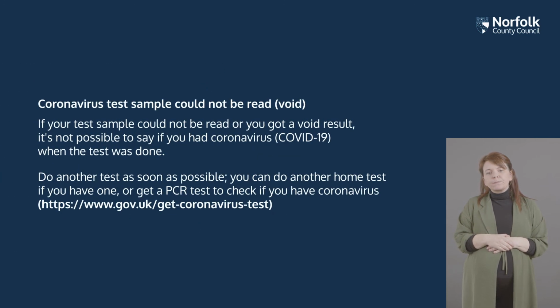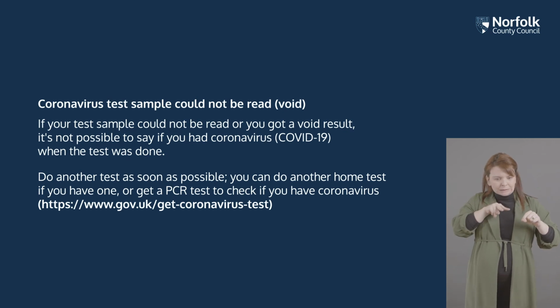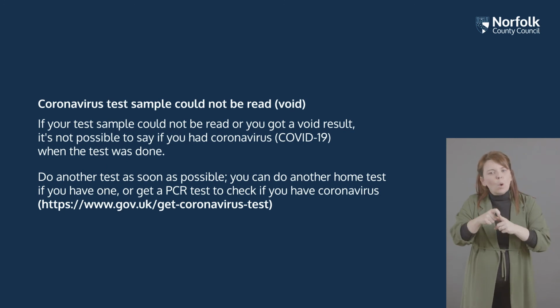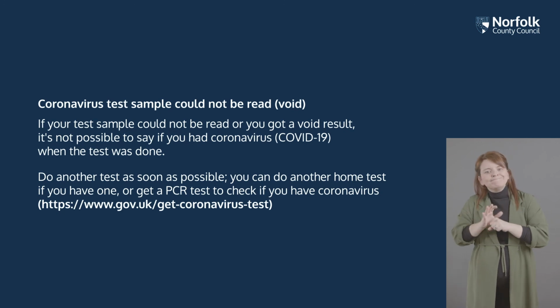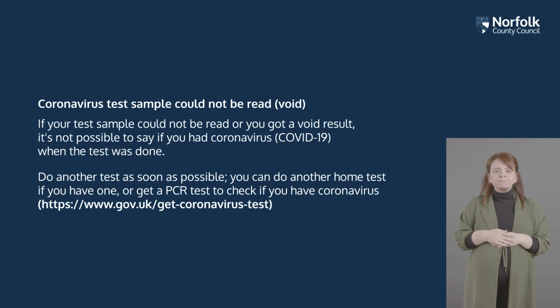Coronavirus test sample could not be read. Void. If your test sample could not be read or you got a void result, it's not possible to say if you had coronavirus, COVID-19, when the test was done. Do another test as soon as possible. You can do another home test if you have one, or get a PCR test to check if you have coronavirus.